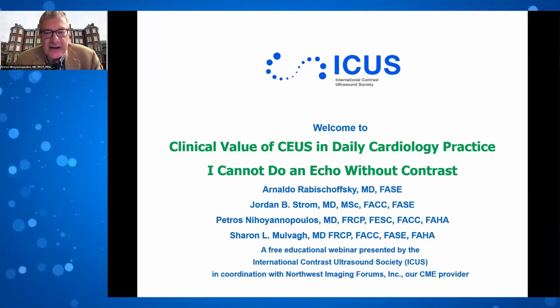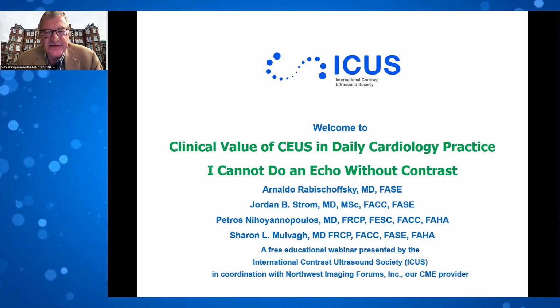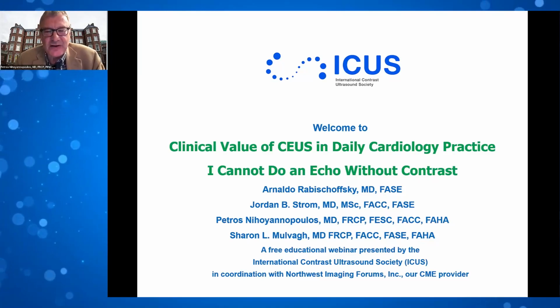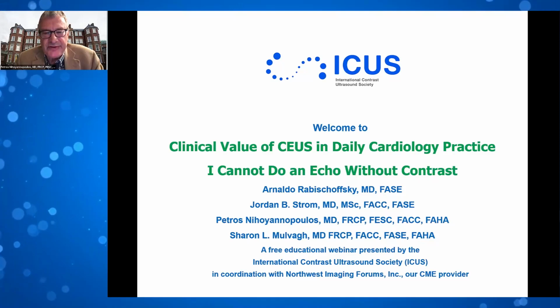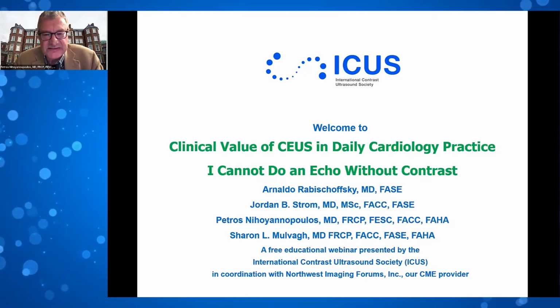We have a fantastic session on "I cannot do an echo without contrast." This is really a masters of contrast ultrasound who will tell us how we can use this wonderful technique in daily clinical practice.